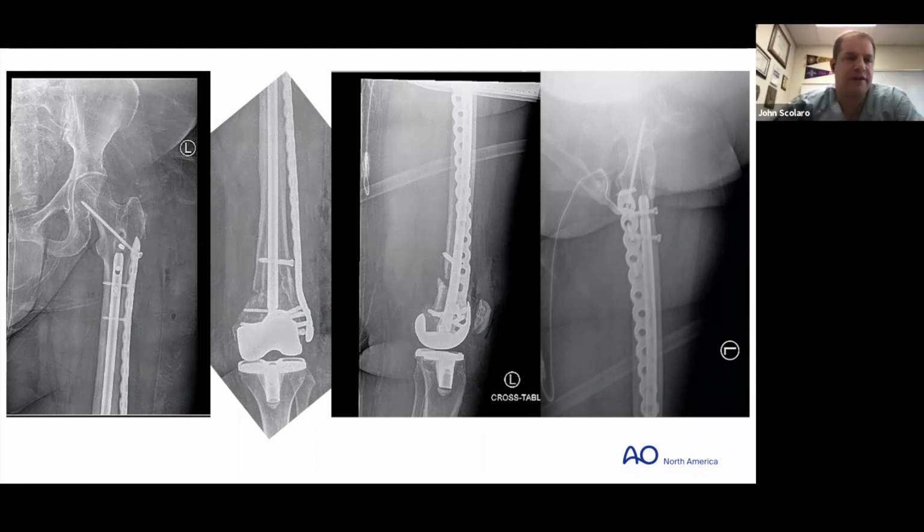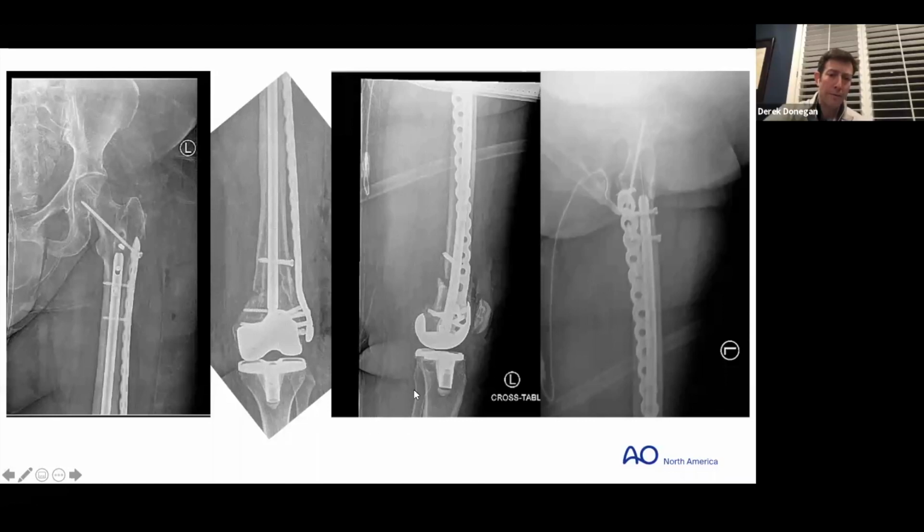I don't use a ton of stuff off the shelf. If I use something, I'll use reamings or iliac crest or posterior crest or something like that. If I need to bulk up what I have, then I'll use crushed cancellous or DBX or something like that. But that's about it. Nothing that really has cells in it. I don't usually acutely bone graft these at the time, except for non-union stuff. But in the acute setting, I have not been doing that.